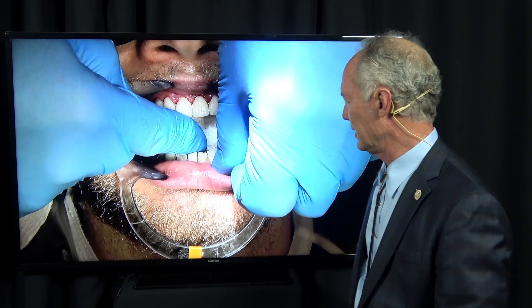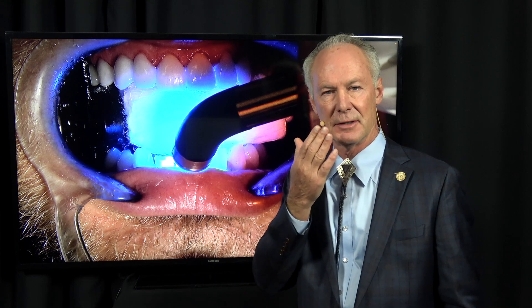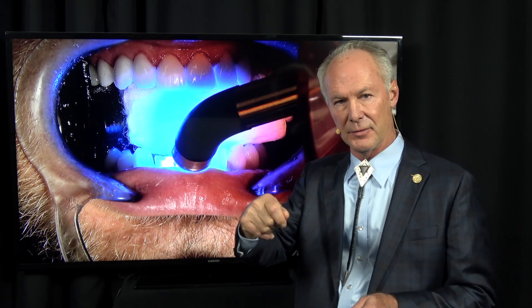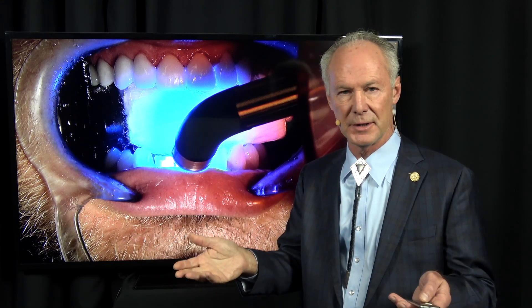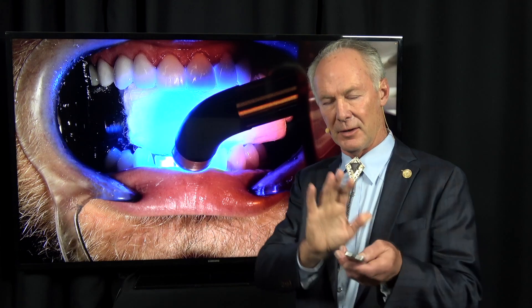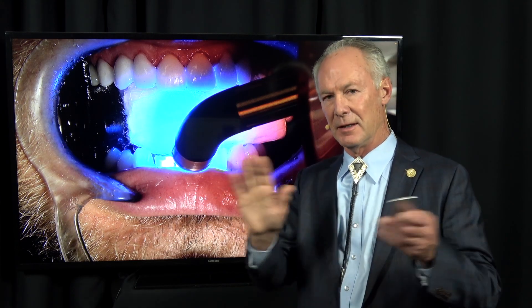Floss between any teeth that have contacts. Here's the key: with direct composite, cure the primer adhesive once you've blown off the excess. With any direct composite — incisal, facial, occlusal — blow the primer adhesive off onto the two-by-two, then cure it for about four to five seconds. Whereas with a veneer, you don't cure anything until all the veneers are placed; then you cure the blown-off primer adhesive and luting composite all at the same time once all veneers are seated.